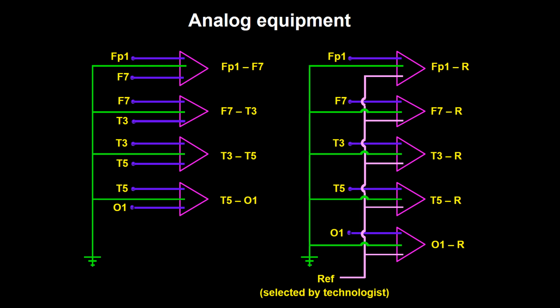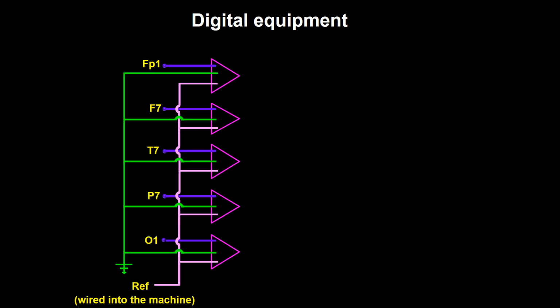In the next frame, I am going to take you to a different world. That is the world of digital EEG. For the explanation of digital equipment, I will use the modified 10-20 system guidelines. Take a moment to look at this figure.